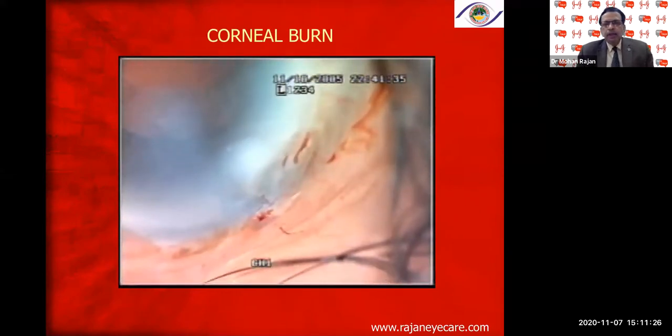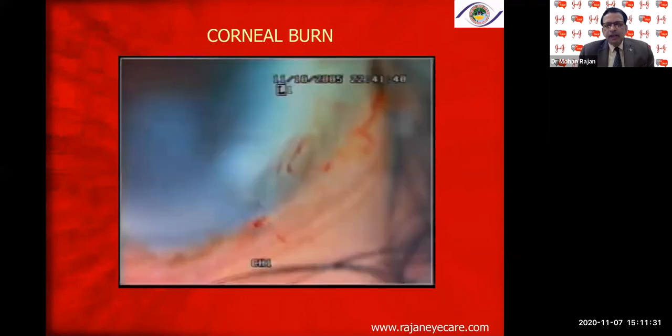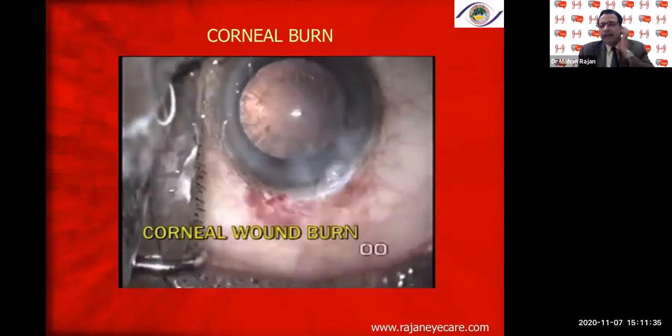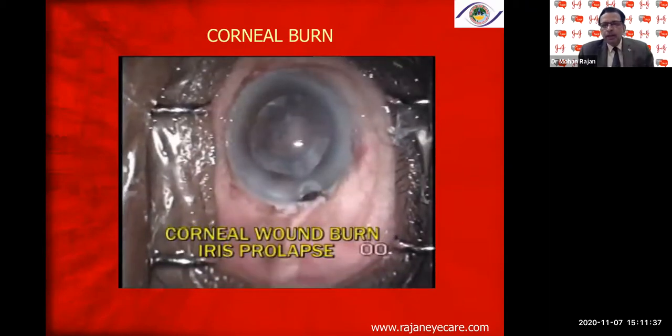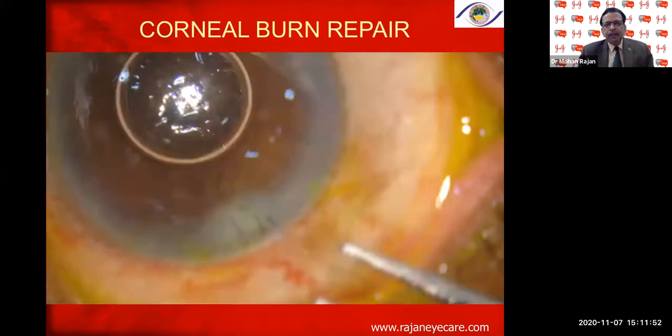If you have excess phaco energy, or a tight wound, or if you have not removed the viscoelastic, especially Viscoat, and try to give phaco power, these corneal wounds can be very, very dangerous because they can produce irregular astigmatism, wound gaping, infection, and even recurrent inflammation. Because with these corneal wounds there is a wound gape, and also an ingress of fluid from the conjunctival sac into the anterior chamber as well.